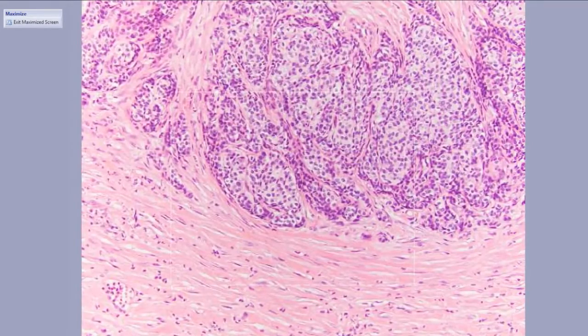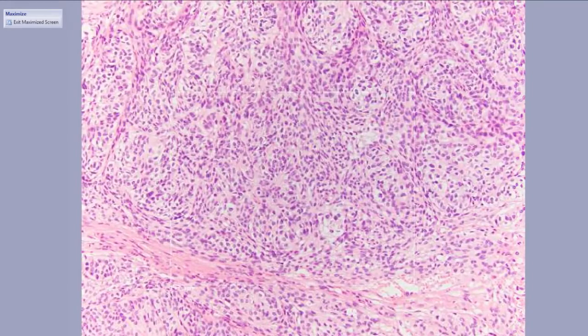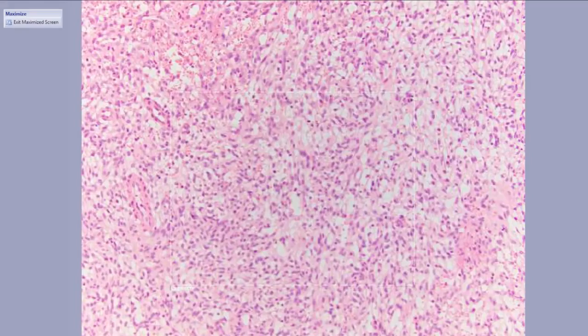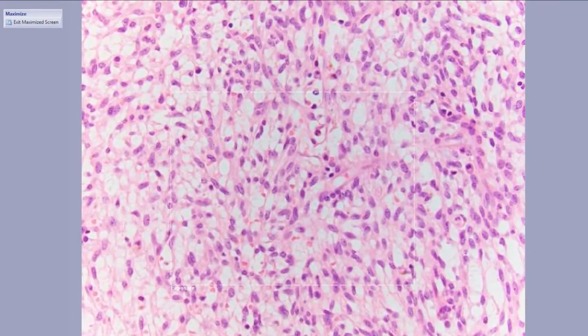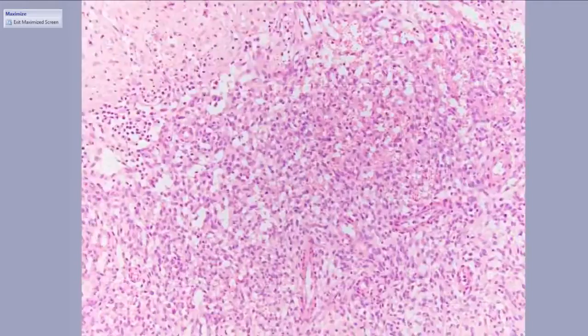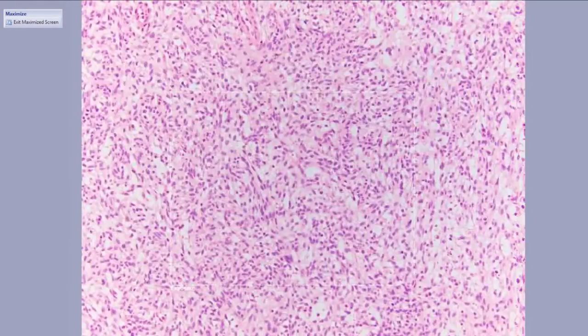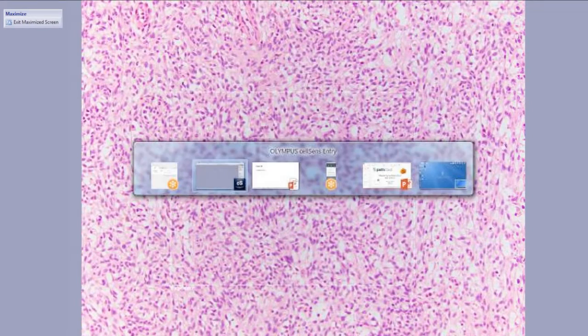It looks well behaved though. No striking atypia, no necrosis. This is the epithelioid component, maybe very focally a little spindly. But if you want spindly, let's go over to the other component, which looks very different overall. Very spindle. This is kind of loose, primitive mesenchyme. Although overall it's fairly bland as well, no necrosis, no mitoses. So we have a stomach mass with a biphasic appearance, and this also has that MALAT1-GLI1 fusion.